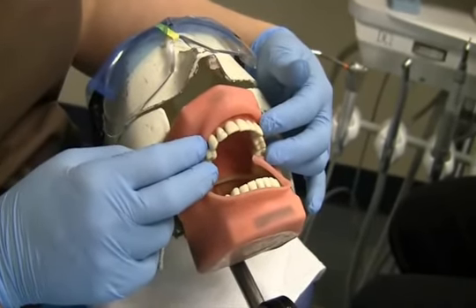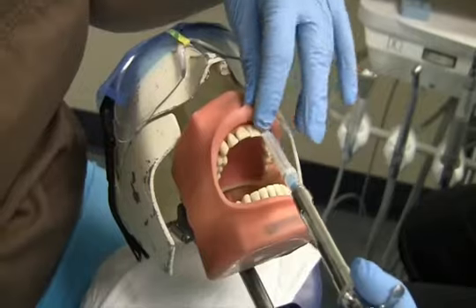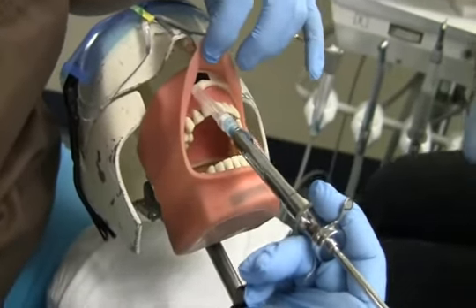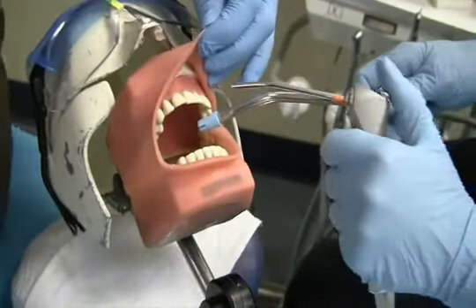After the dental assistant has placed the topical anesthetic in the appropriate places to freeze the appropriate nerves, the dentist will take the syringe that has already been prepared with a short needle. While the dentist is giving anesthetic, the dental assistant will be ready to give a courtesy rinse after the dentist has finished.